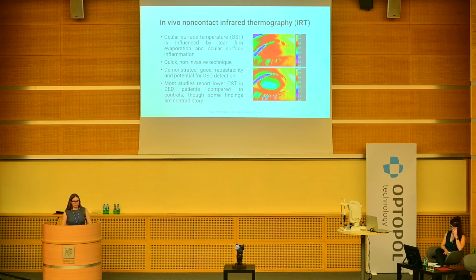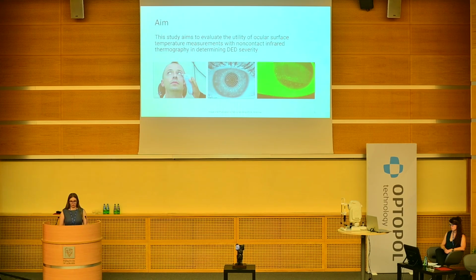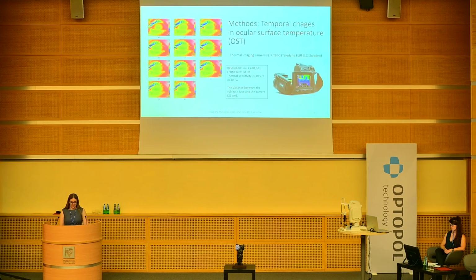It is a pretty quick and non-invasive technique, and it already demonstrated really good repeatability. In our study it was also visible that it has way better repeatability than, for example, non-invasive breakup time, which is a pretty positive observation. So the aim was to evaluate the utility of non-contact infrared thermography in diagnosing dry eye disease severity. And there will be a few observations on that.